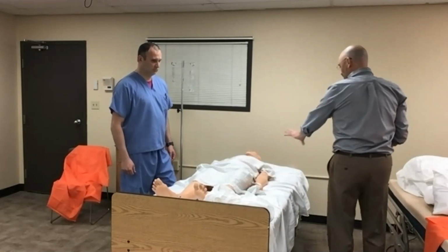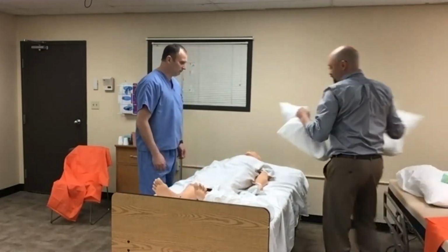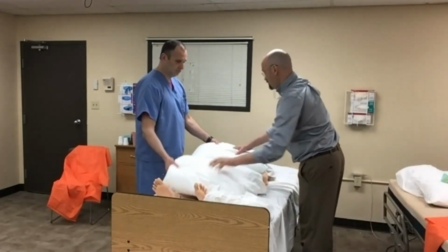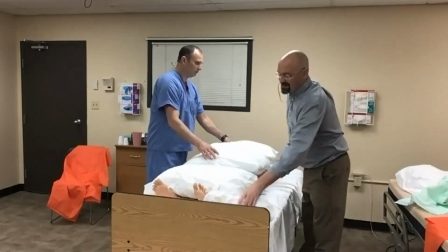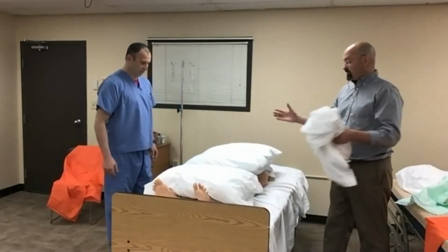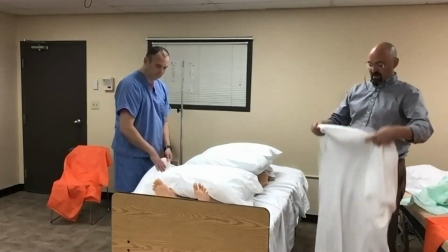So our patient, we're going to clean the tubes, EKGs and everything off our patient. We're going to get our pillows preset. We're going to take a second, and again, if they have a large abdomen, you need more pillows at the chest or the legs, you can do all of that at this point.